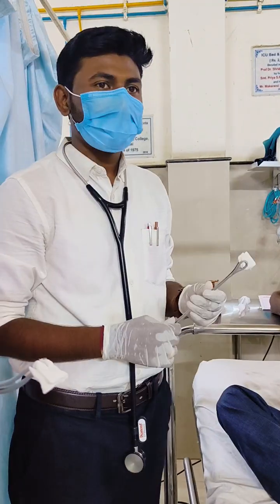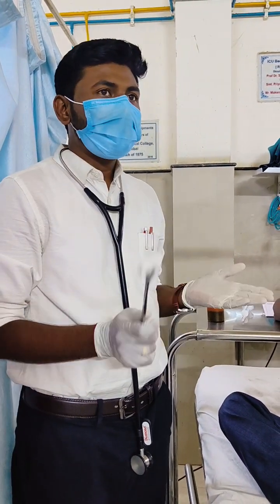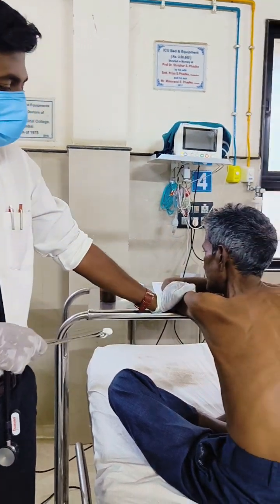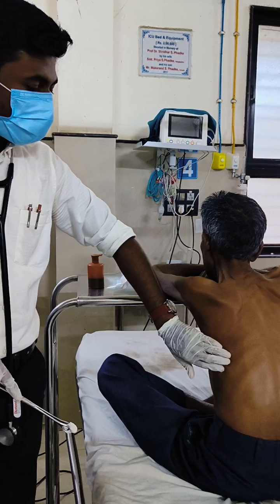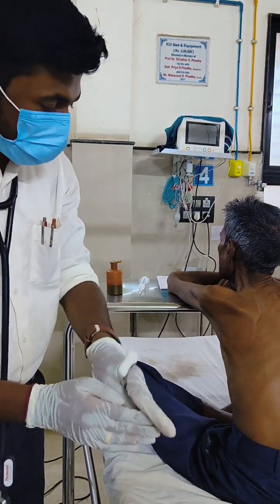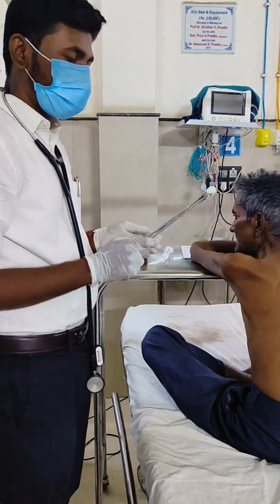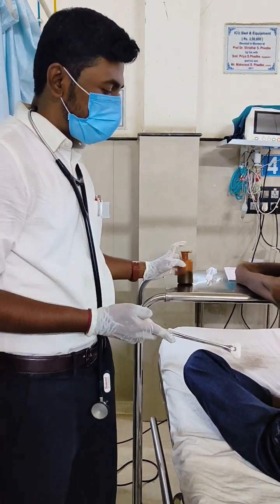For the tapping, there are two techniques. The first one is the patient sits in this position so that we have good exposure of the ribs from the back. One more method is to make the patient lie down and prick here so that fluid will come. Now he is having massive pleural effusion, so fluid will come very easily. So first you have to clean the part.